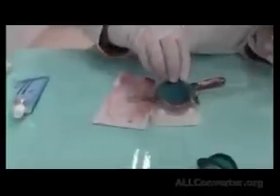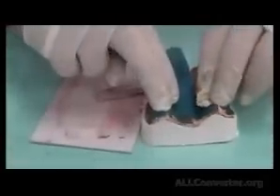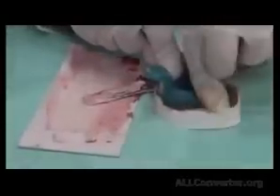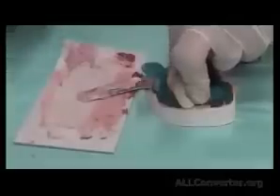Zinc oxide eugenol has a good working time, and it's reasonable to be working with it for you as students. And then we're going to apply it over the cast that has Vaseline. So if it was the patient's mouth, we will first seat the tray in place. We squeeze first from the back to front. What will happen is, once we squeeze from the back to front, we will have less excess material posteriorly, and we will have the excess come from anterior.